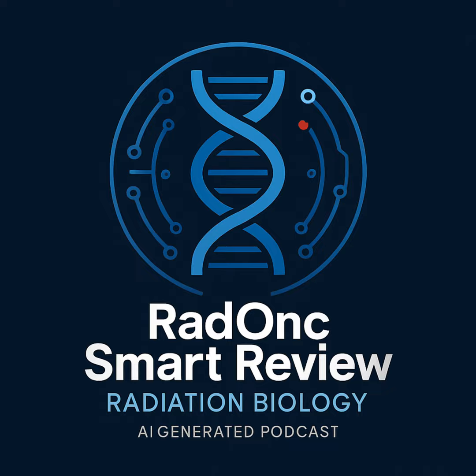And critically, the power of combined PET-CT, fusing that anatomical roadmap from CT with the functional landscape from PET for precise localization. This is essential for modern radiation oncology planning. Absolutely. These tools are fundamental for diagnosis, staging, planning, response assessment, and they're pushing us towards more biologically driven, personalized treatments. So keep reviewing, keep practicing those questions. You are building a really strong foundation. You can definitely handle this on the boards.